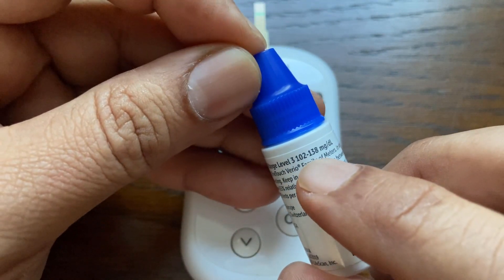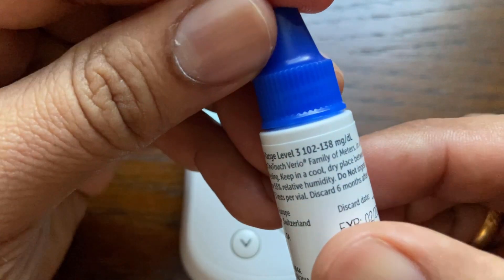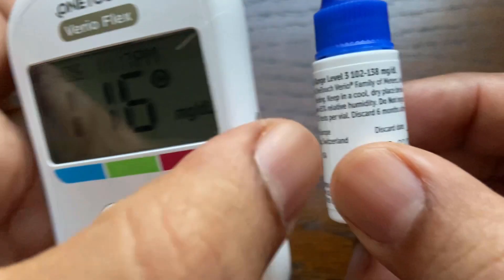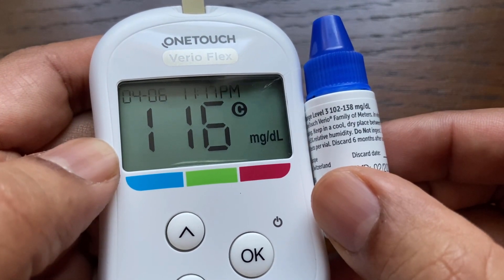In this case, the control solution is Level 3. The expected value should be between 102 and 138 for Level 3, and the reading we obtained is 116, which is within the range. The control range is also printed on the test strip bottle.